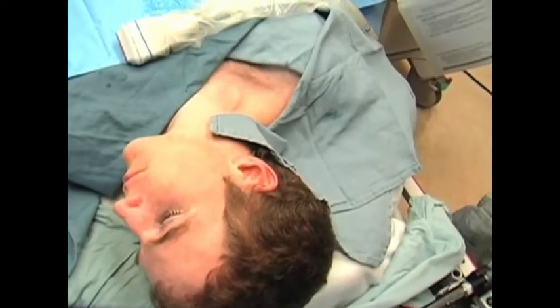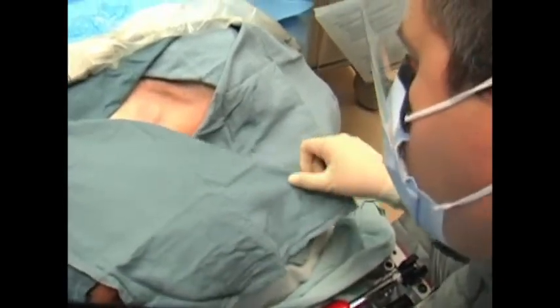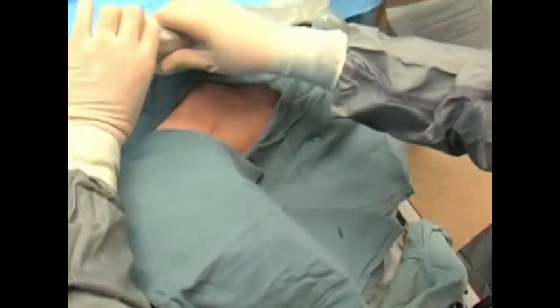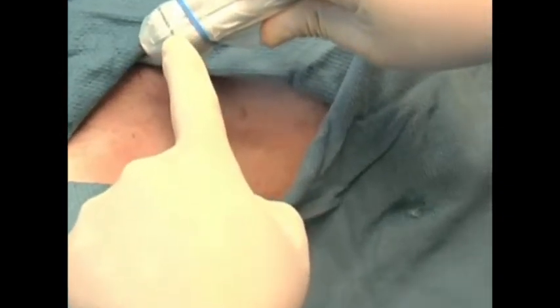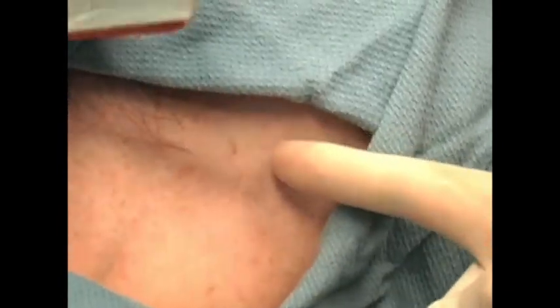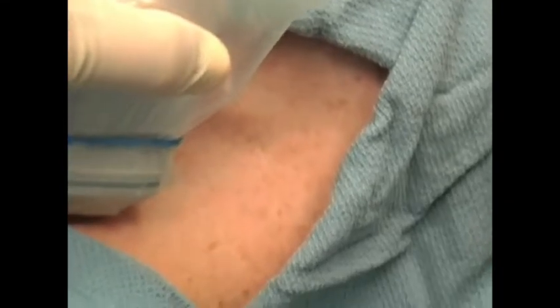Now Dan is back in position at the head of the bed. We're going to proceed with the middle approach to the IJ. He's going to place the transducer on the patient's neck with the indicator towards the patient's left side. The transducer will be placed slightly above the clavicle, with the medial or indicator side slightly angled towards the patient's feet.